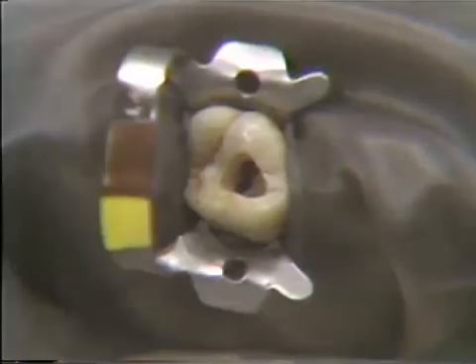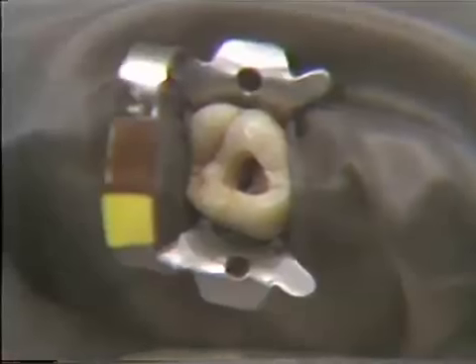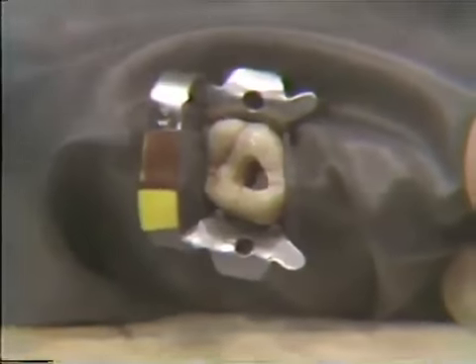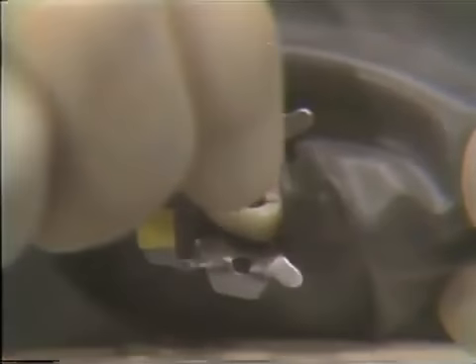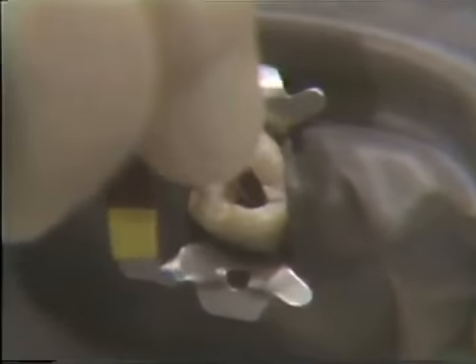Locating the orifice of the canals is only half the battle. You have to get the files into the canals. To do this, your file has to have the proper direction and angulation. To get into the mesial buccal canal, you come from the distal lingual down into the canal, letting the wall of your preparation and your untouched pulp chamber floor guide you right into the orifice and into the canal.